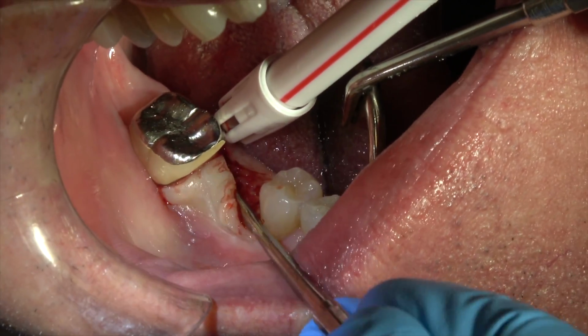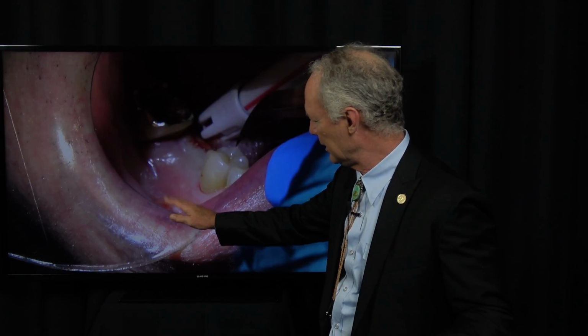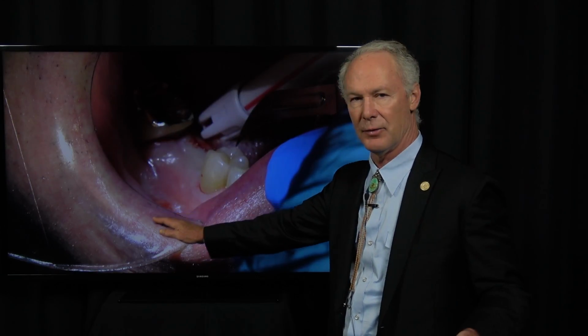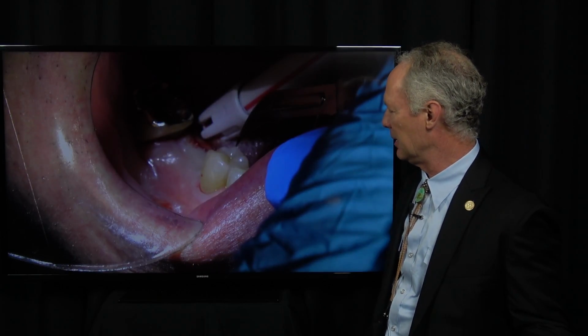The other thing to remember is you've got the mental foramen down here with the mental nerve, and so don't be cutting or retracting or placing a lot of pressure in the region of the mental nerve. The patient could end up with a numb lip.